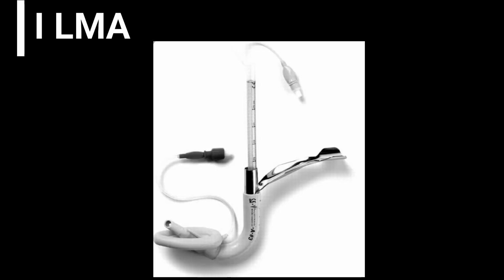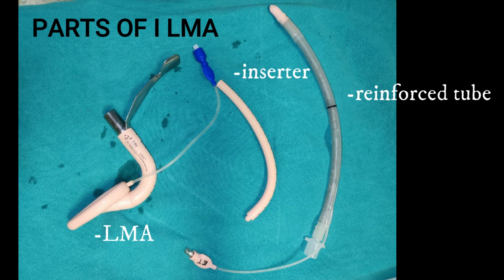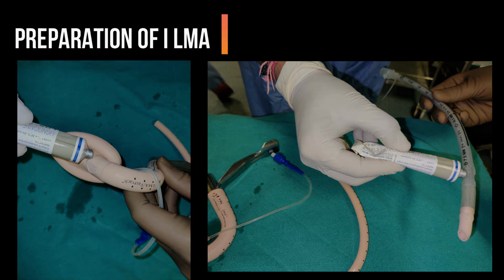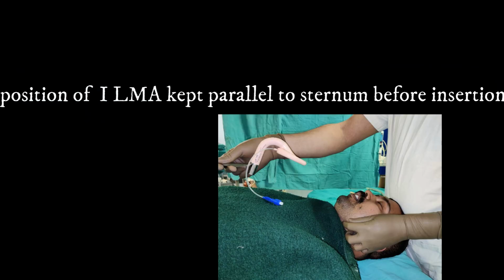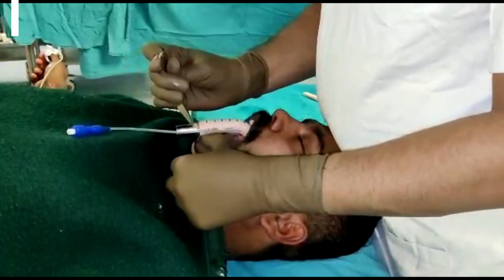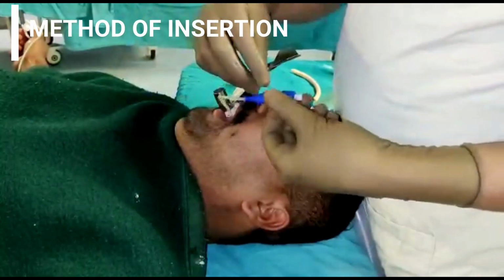ILMA, or intubating LMA, consists of an LMA, an inserter and a reinforced tube. Select the appropriate size, deflate the cuff, and apply water-soluble lubricant to the posterior surface. Maintain proper head and neck position, neutral position, and the patient should be under anesthesia by IV inducing agent and muscle relaxant. It is introduced into the oral cavity holding the rigid handle parallel to the patient's chest.